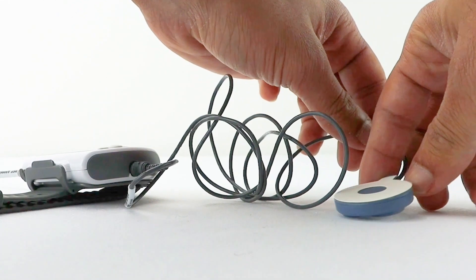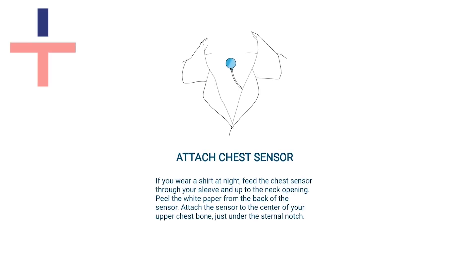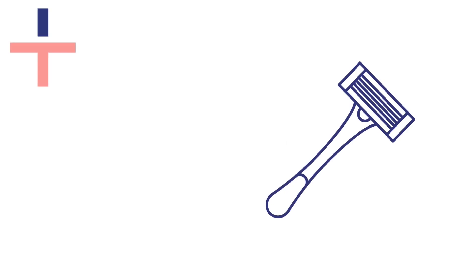Remove the white sticker cover on the chest sensor and apply it directly to your skin as shown here. You can use the hypoallergenic strips to secure the chest sensor in place. You may need to shave your chest hair to allow the sensor to attach securely.